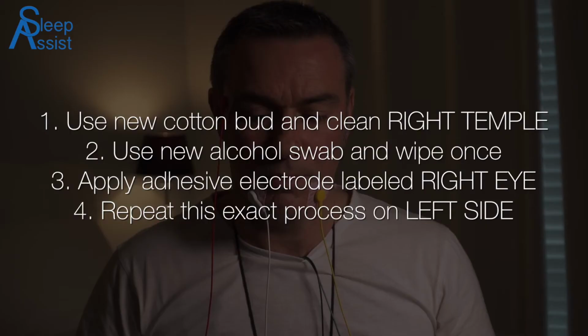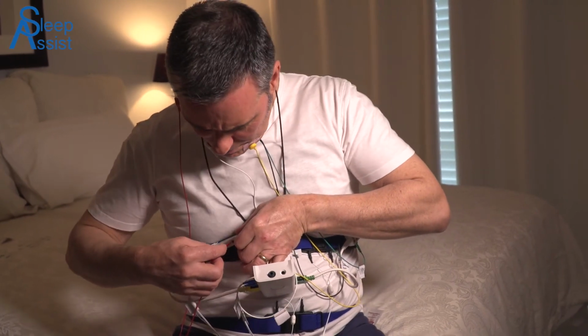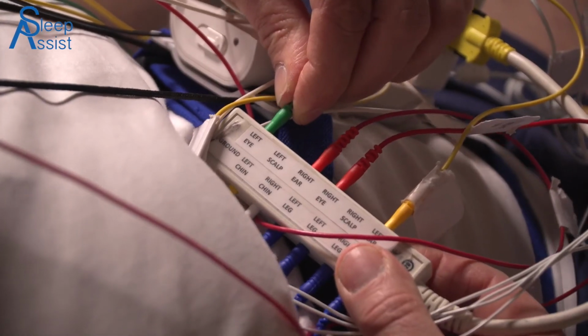Repeat this procedure on your left temple using a fresh cotton bud and a fresh alcohol swab and apply the adhesive electrode labelled left eye. Insert the lead marked right eye into the multi-lead port box labelled right eye. Insert the lead marked left eye into the multi-lead port box labelled left eye.